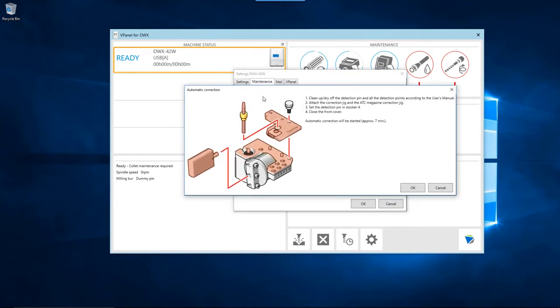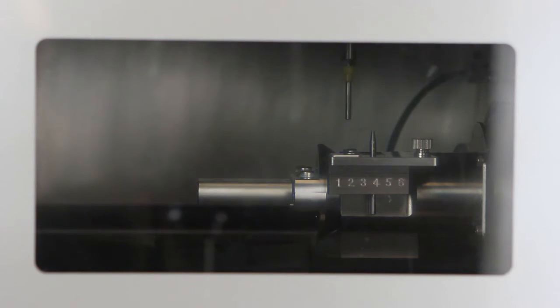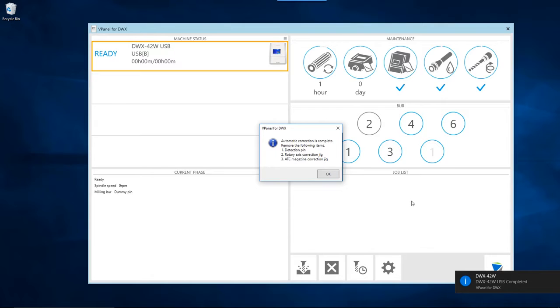Click the OK button when you have confirmed that all work pieces have been removed from the mounting part and both correction jigs are set up properly. Once the operation is completed, click the OK button to close the vPanel popup and complete the automatic correction procedure.